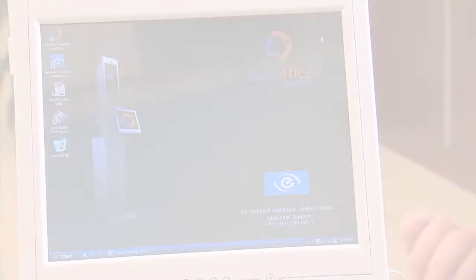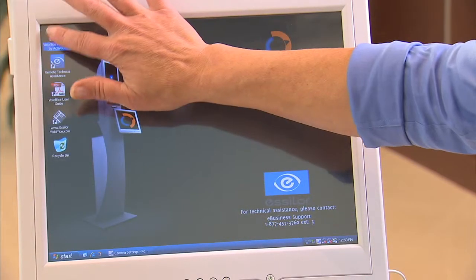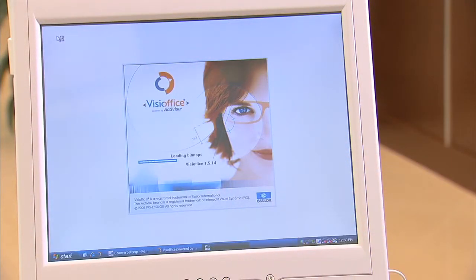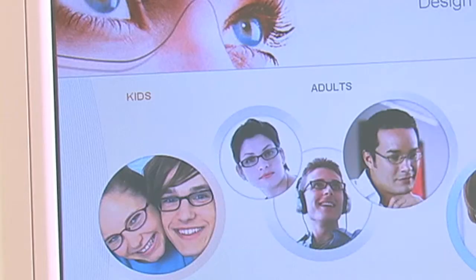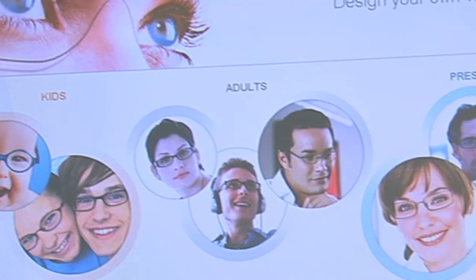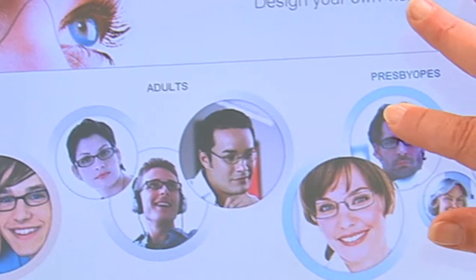Using the touch screen or mouse, click on the VisiOffice icon to begin. Select the appropriate patient type: child, adult single vision, or adult presbyo.